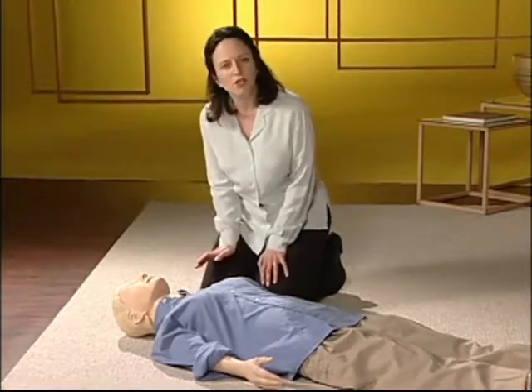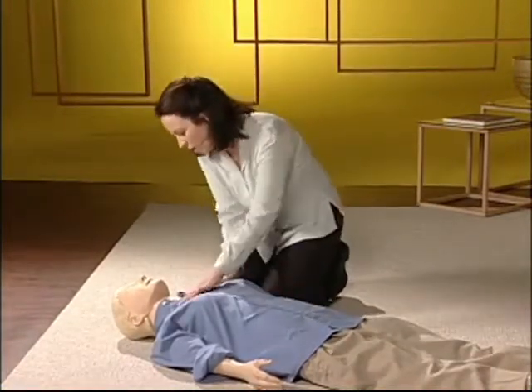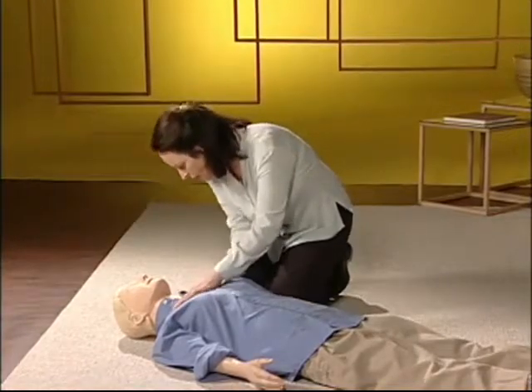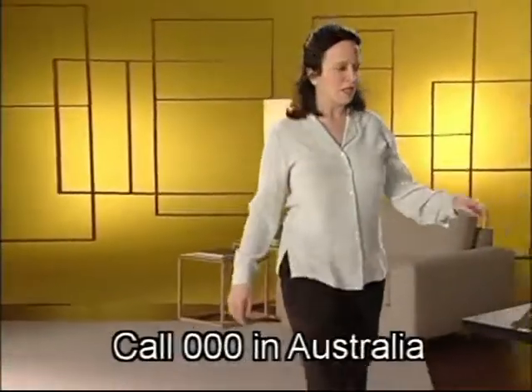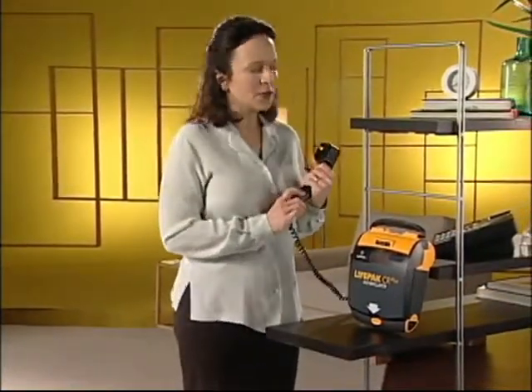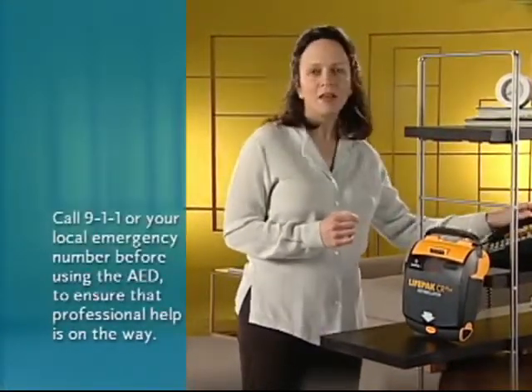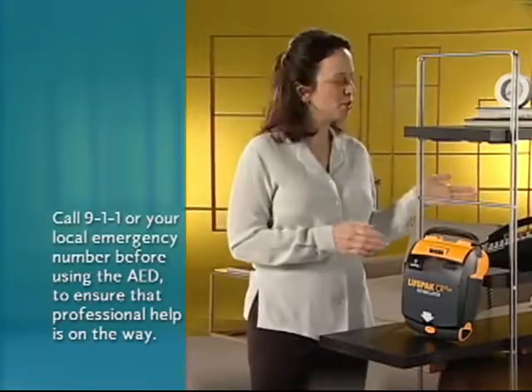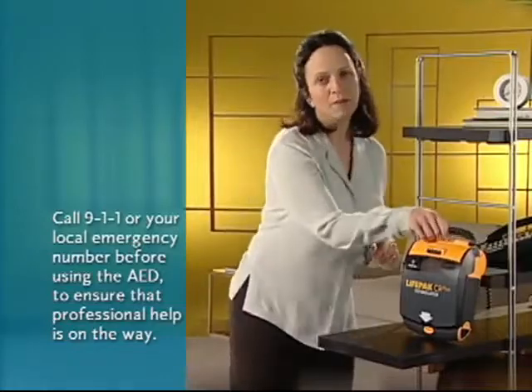The first thing you should do is try to wake them by tapping or shaking their shoulder and calling out, "Are you okay? Are you okay?" If you can't get them to wake up, call 911 immediately, even if you're not sure they're in cardiac arrest. Tell the dispatcher that someone has collapsed and you can't wake them. Tell them you have an AED. Now go get it. If someone else is with you, one of you should call 911 and get the AED while the other starts CPR.